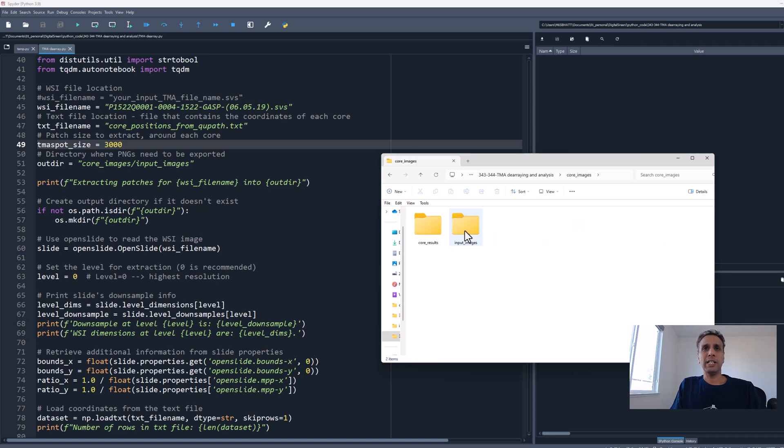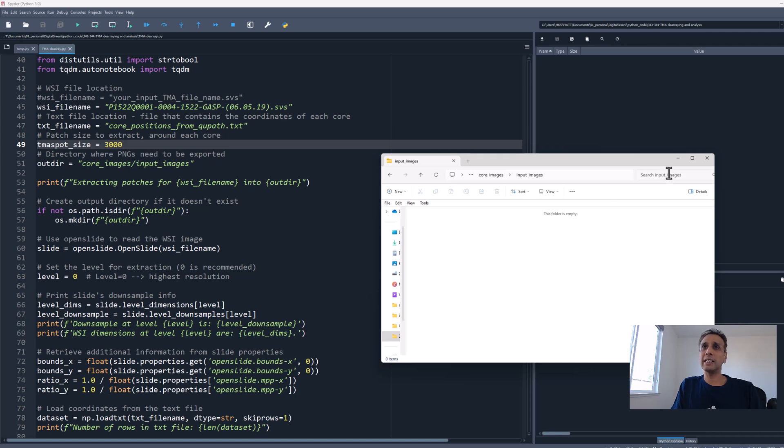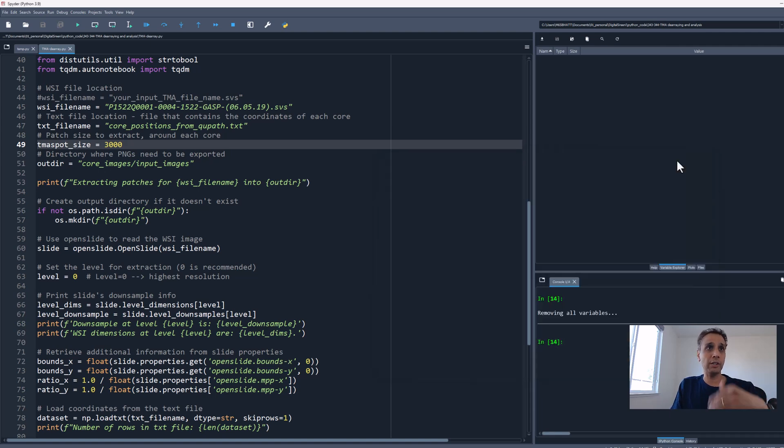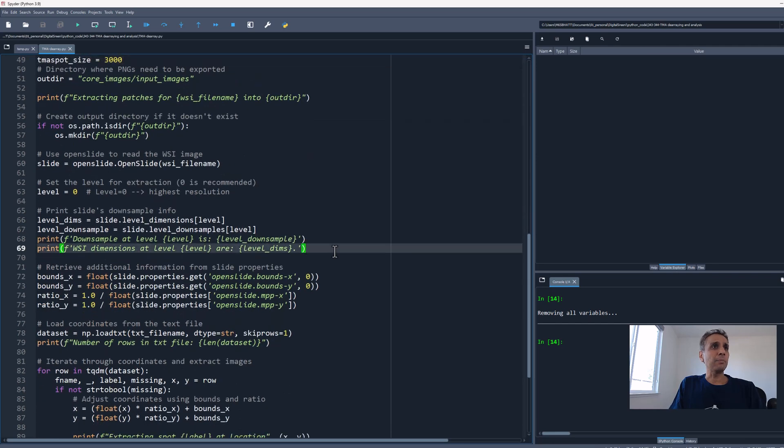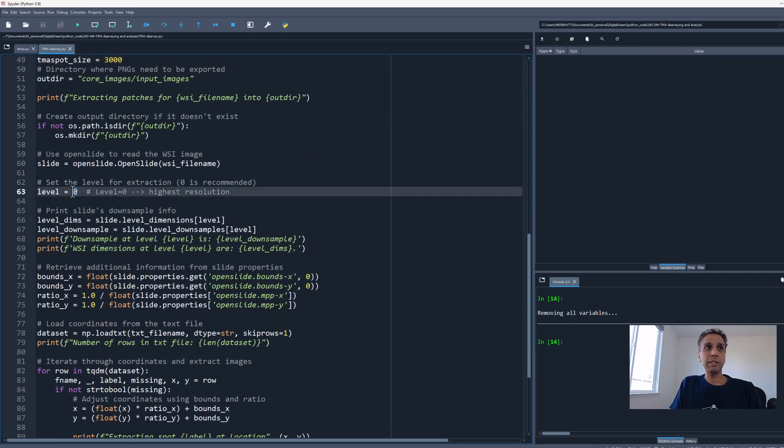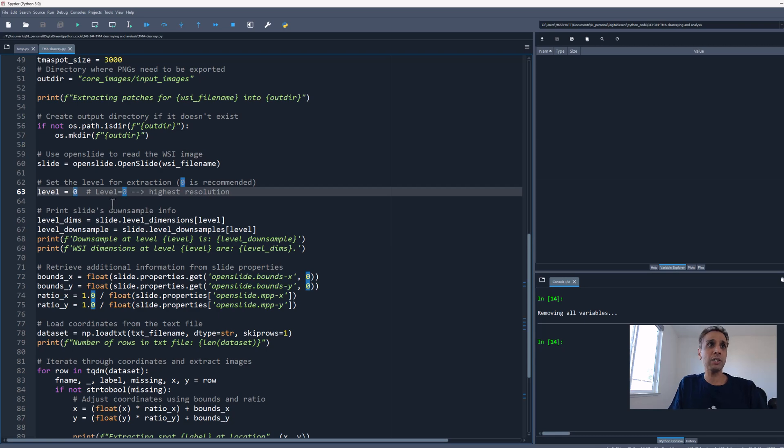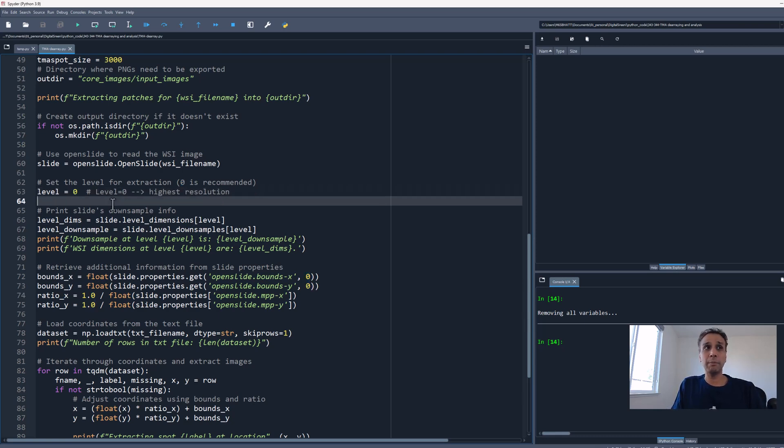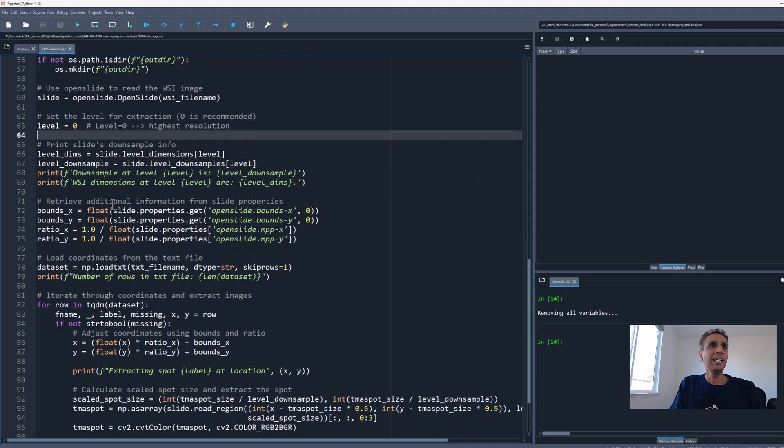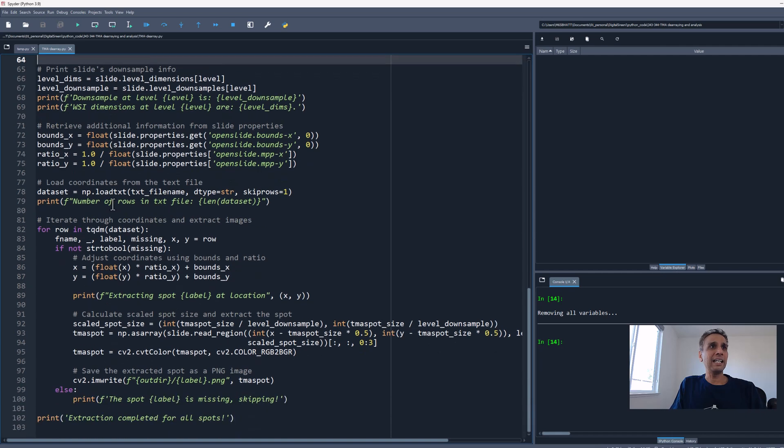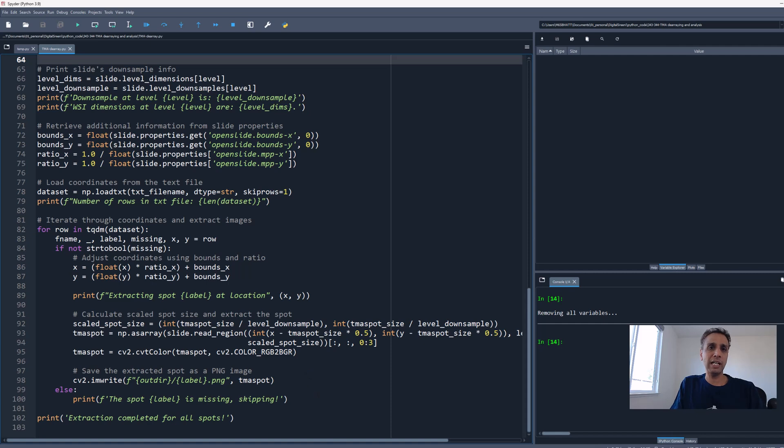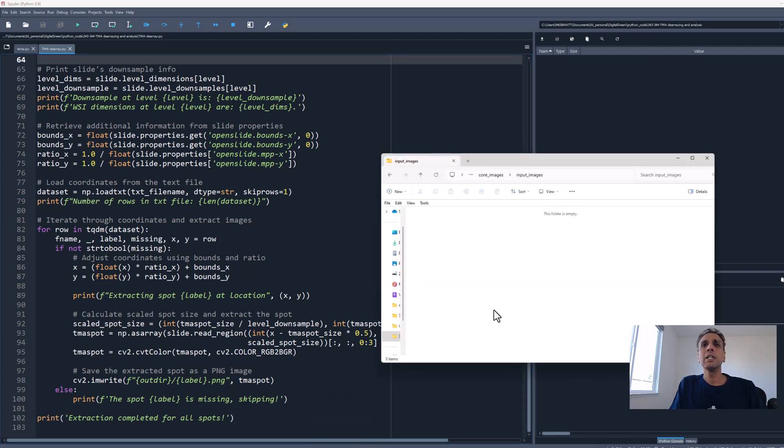Right now I have nothing in my core images and input images. This is my output directory—I've got nothing. Let's keep an eye on this as we run the code. We're extracting level zero, the highest resolution image, and downloading as PNG.